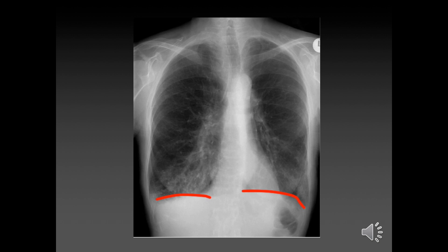This image shows COPD. The reason people with COPD have difficulty isn't because they can't breathe in — it's because they can't breathe out, so their lungs are hyper-expanded. This is what we call emphysema. Because this is chronic, they end up with really flattened diaphragms on chest X-ray, which is quite marked. If you see a patient with COPD, you can usually expect to see more than seven anterior ribs on their X-ray.